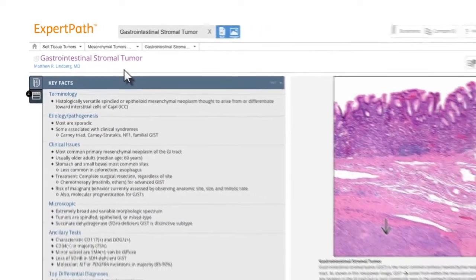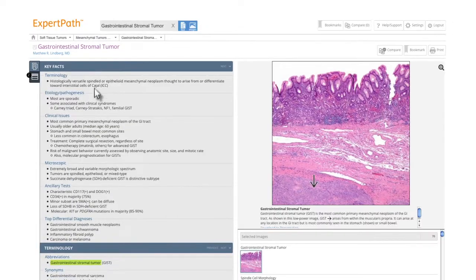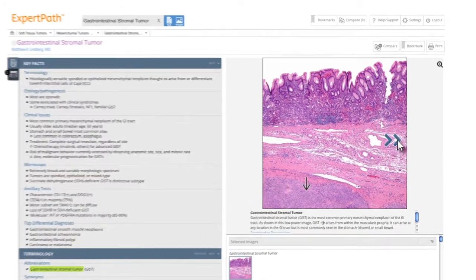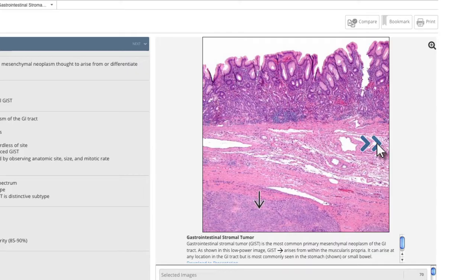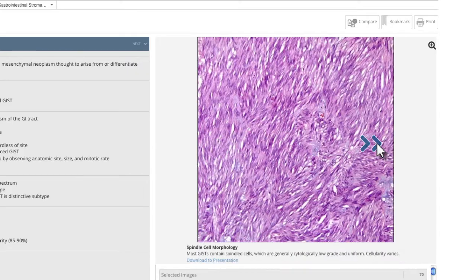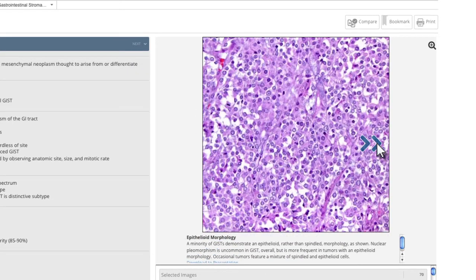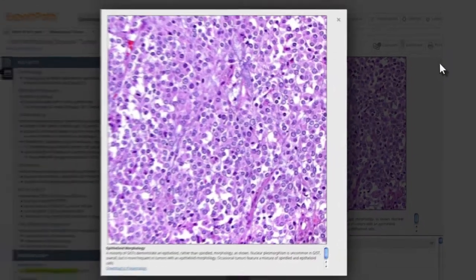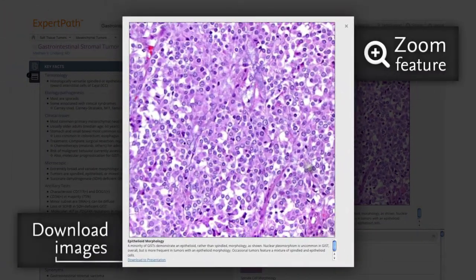Each diagnosis follows the same organizational format, making it easy to locate the information you need. On the right, the diagnosis is supported by high-quality images of both normal and abnormal pathology. An image can be downloaded for a tumor board or presentation.